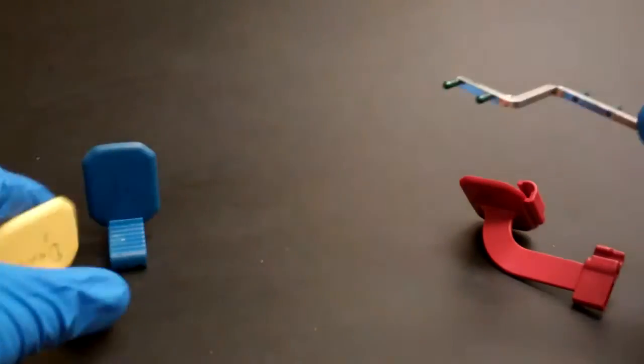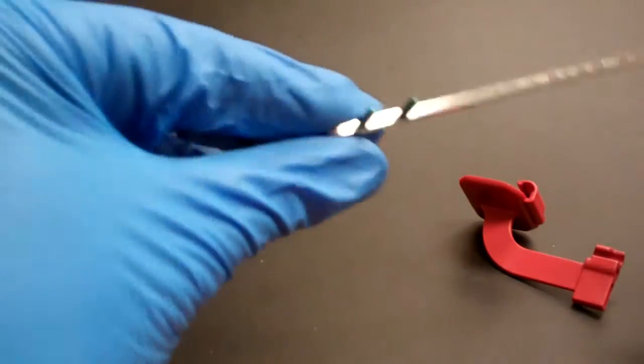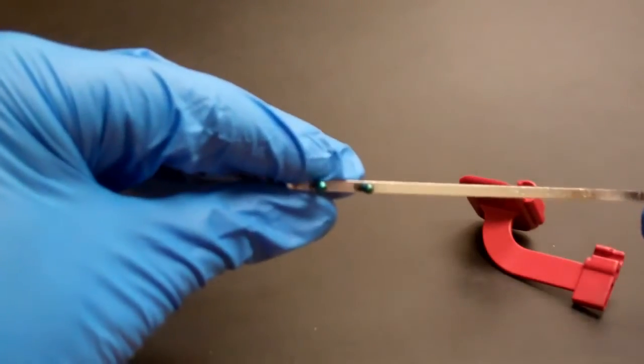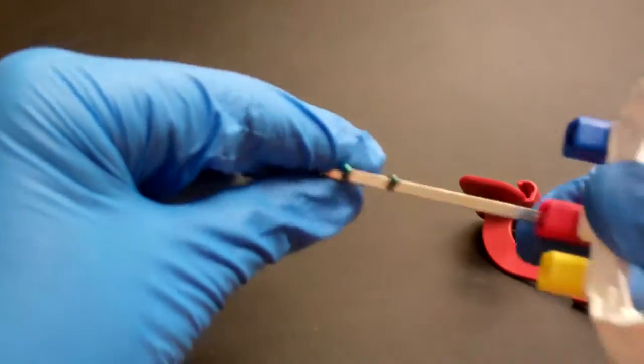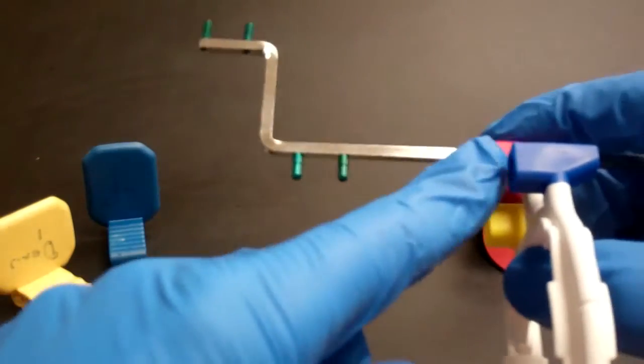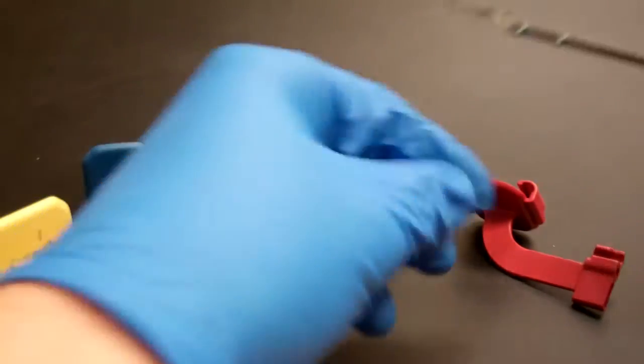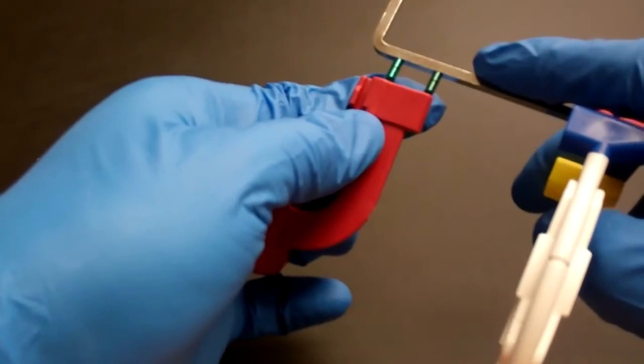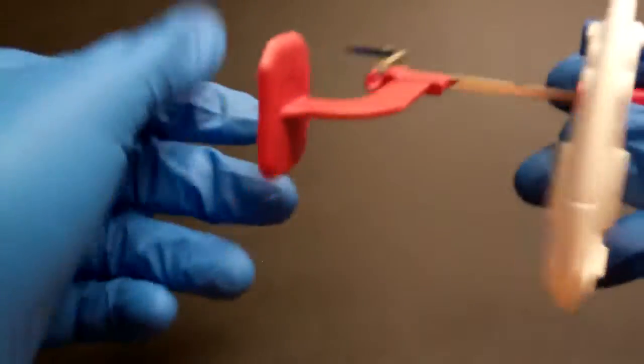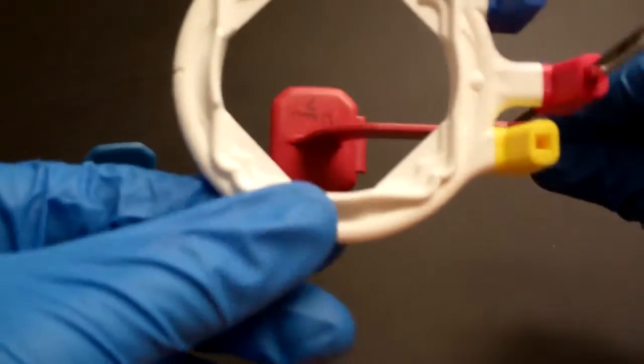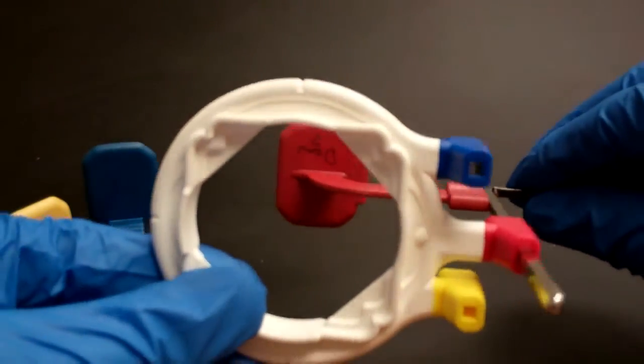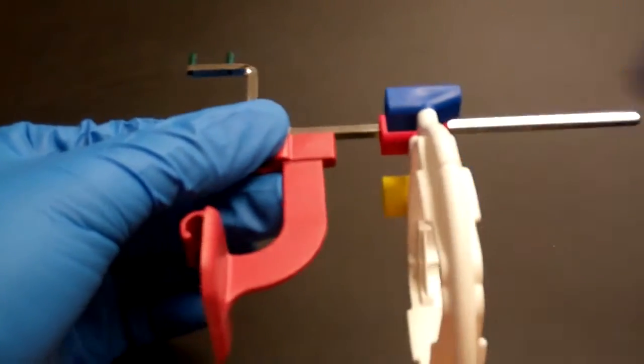And also for bite wings, we would just flip over the arm so we have the pins that are closest to the ring on the arm pointing in and then we would put our bite wing bite block on there. This little part here would be sticking out of the patient's mouth. You can kind of see how that works.